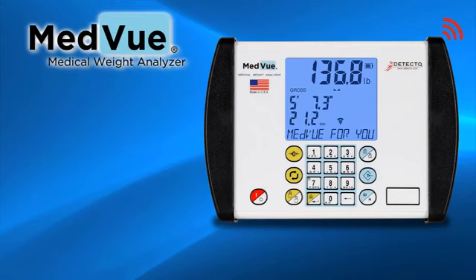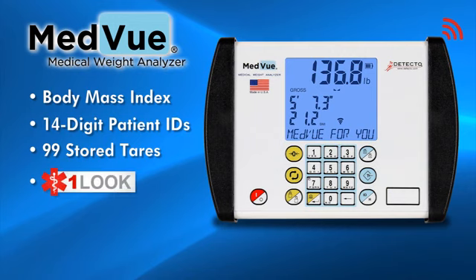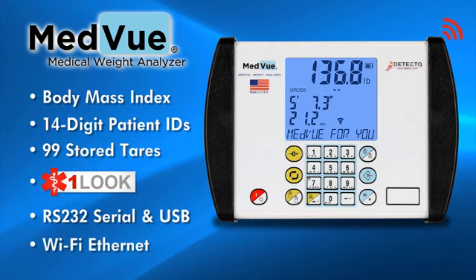The 7550's MedVue Indicator offers a host of other valuable features for clinical weighing: body mass index, 14-digit patient IDs, 99 stored tare weights for wheelchairs, and an exclusive one-look feature showing weight, height, and BMI all on screen simultaneously. RS-232 serial and USB ports are standard for EMR and EHR output, and the indicator also features optional Wi-Fi Ethernet connectivity.